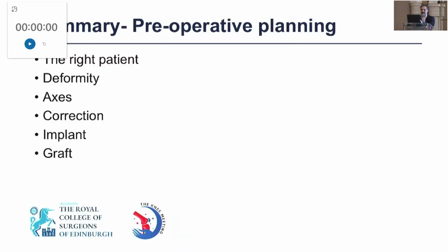But in summary, yes, the right patient, know where the deformity is, know where your axes are, how you're going to correct it, what implant you're going to use. I personally don't use bone graft.